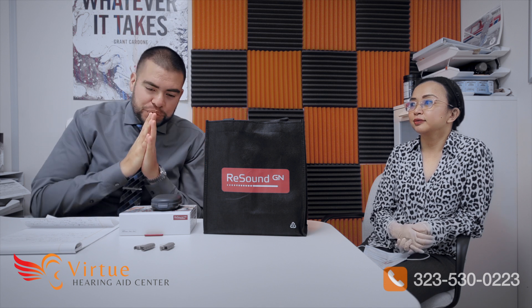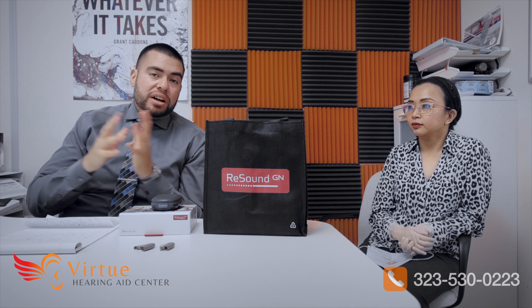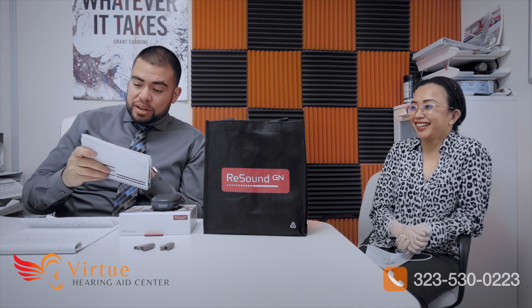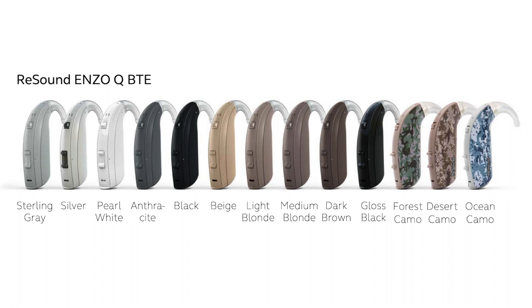These hearing aids have a ton of colors to choose from — 13 colors total. We've got sterling gray, anthracite, black, beige, light blonde, medium blonde, dark brown, pearl, silver, gloss black, forest camo for the hunters, desert camo, and ocean camo.